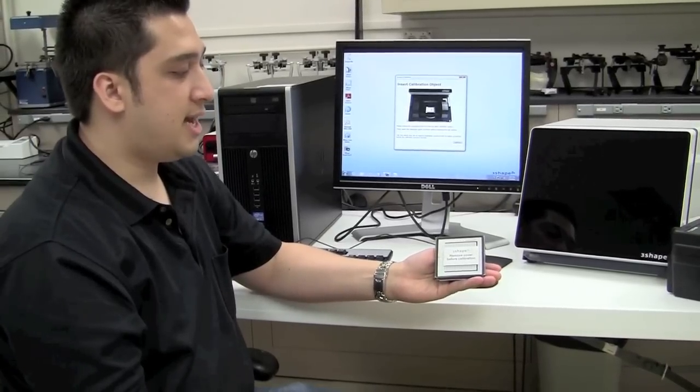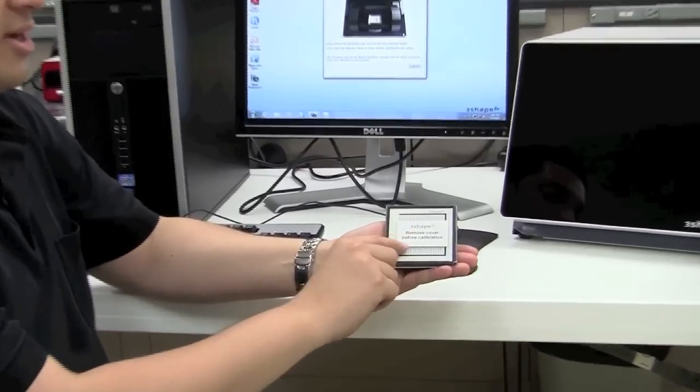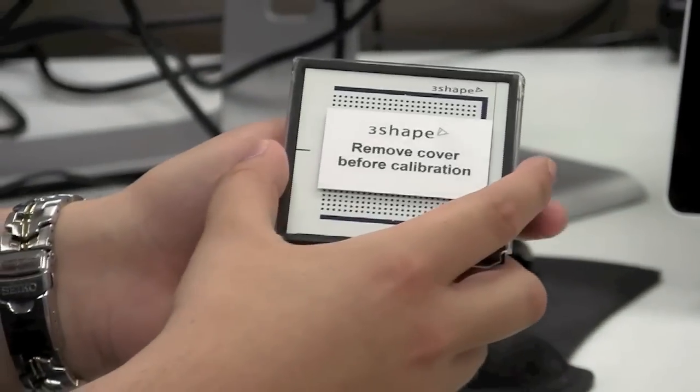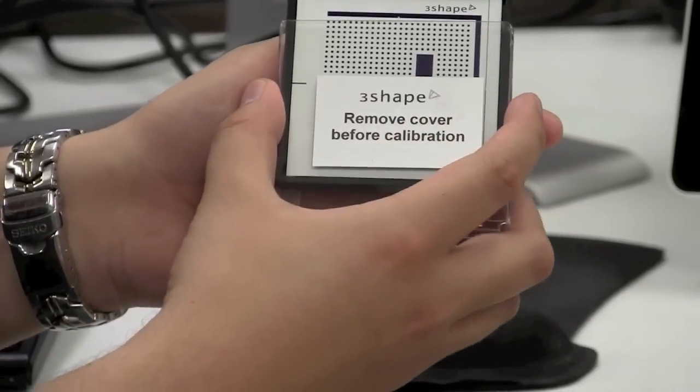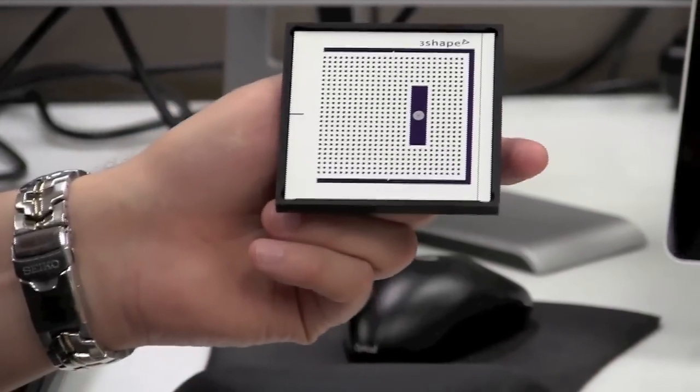What we'll notice on the calibration item is a little notification that says to remove the cover before calibration. There's a small plastic cover that protects the calibration item. You want to make sure you replace this when you're done, but to remove it, just slide it straight down and then place it aside for now.